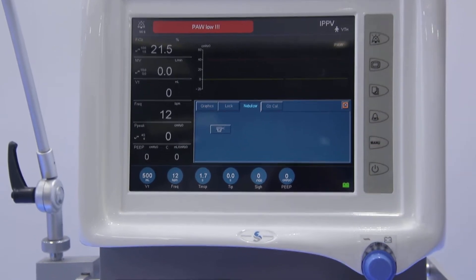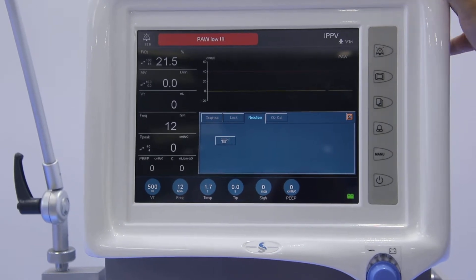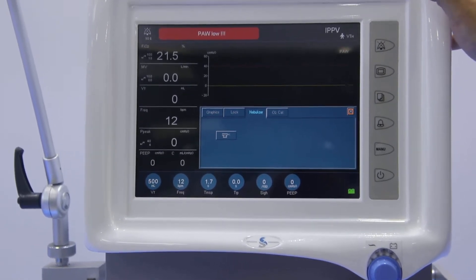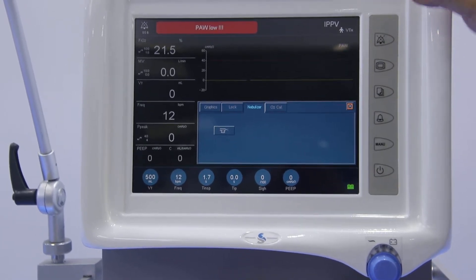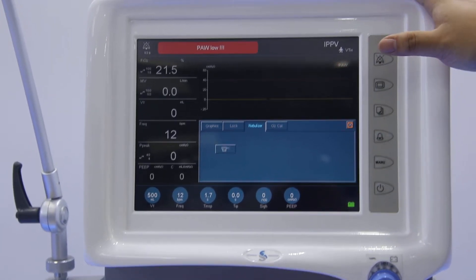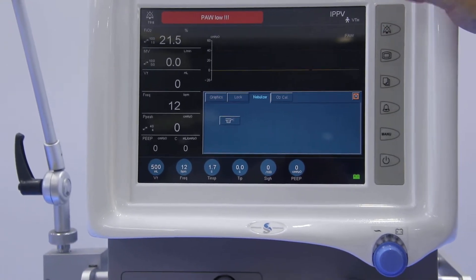The fourth one is the nebulizer function, also we call it the atomization. It means usually for some children and neonatal, they may need the medicine to mix with the breathing gas together for the curing of the disease. So we can use it. And this button is automatic. Once we press it, it will automatically give the gas with the medicine together.